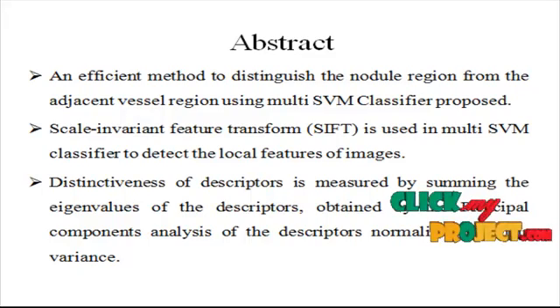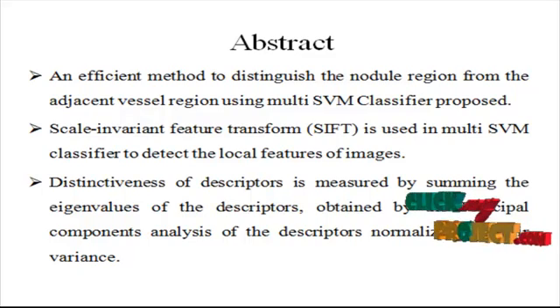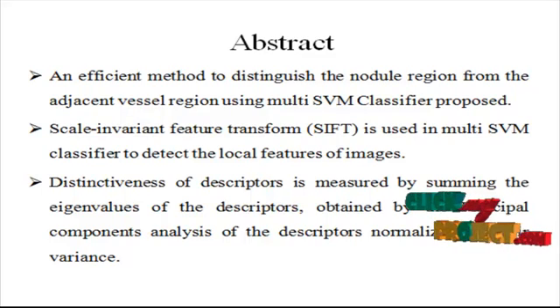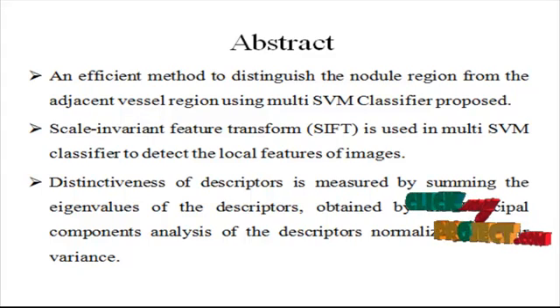Nodule growth, based on two scans performed for a patient typically within the span of 3 to 6 months, is the most notable predictor to identify a malignant nodule. If the volume of the nodule has increased significantly, then the nodule is often considered to be malignant. Accurate manual assessment is time consuming and highly inaccurate. Computer-aided detection for lung cancer provides new technology for automated pulmonary nodule segmentation. Accurate segmentation is essential for exact assessment of nodule growth.